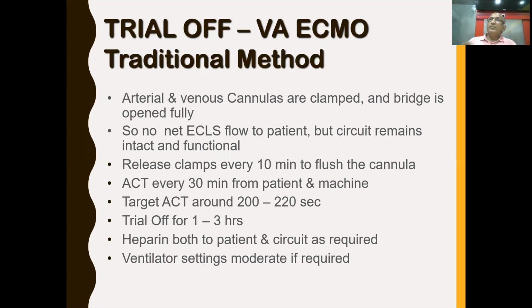And every 10 minutes, we release the clamp for a few seconds so that whatever blood has accumulated in the cannula goes back to the patient. So the patient is connected to the circuit only for a few seconds every 10 minutes. Otherwise, the patient is off. We have to do ACT every 30 minutes.